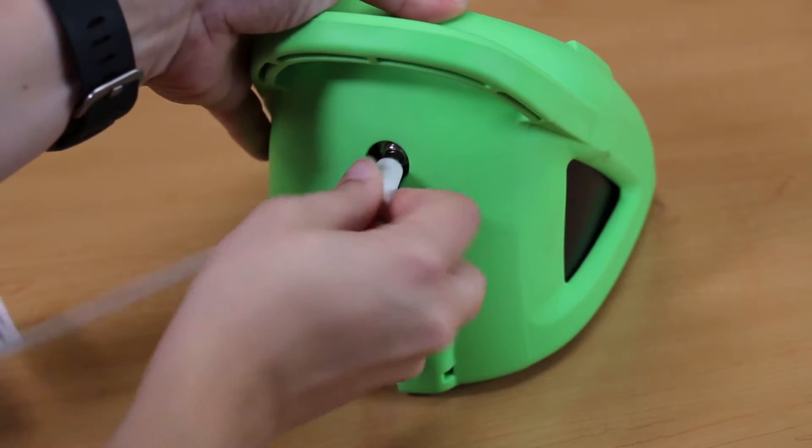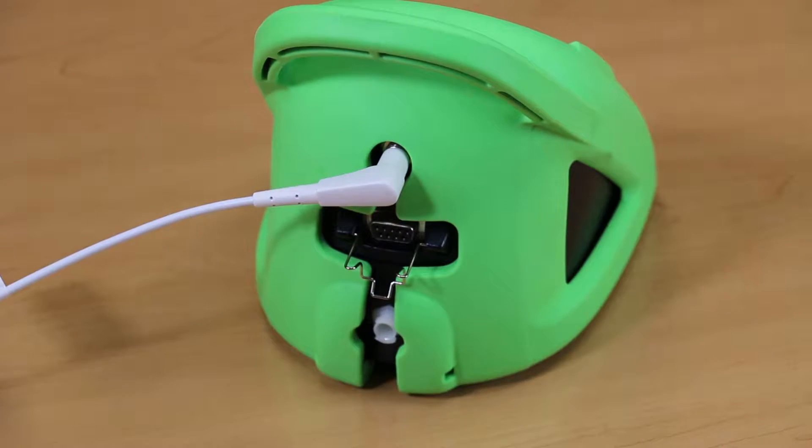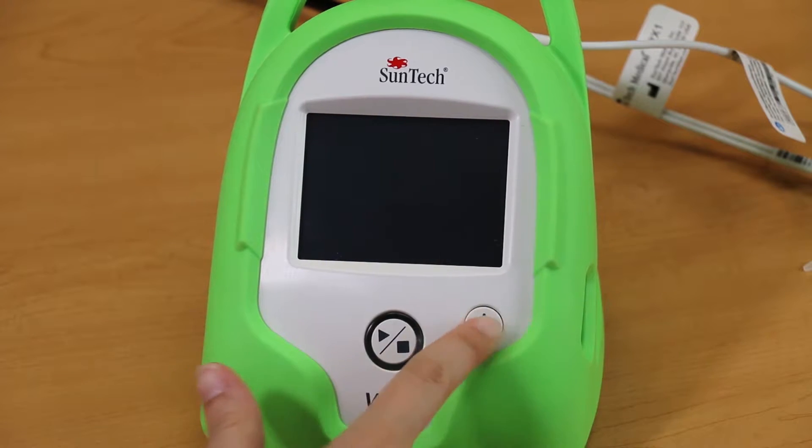Connect the AccuVet temperature probe to the back of the SunTech VET30 Continuous Vital Signs Monitor. Turn on the monitor and select the size of the patient you are monitoring.